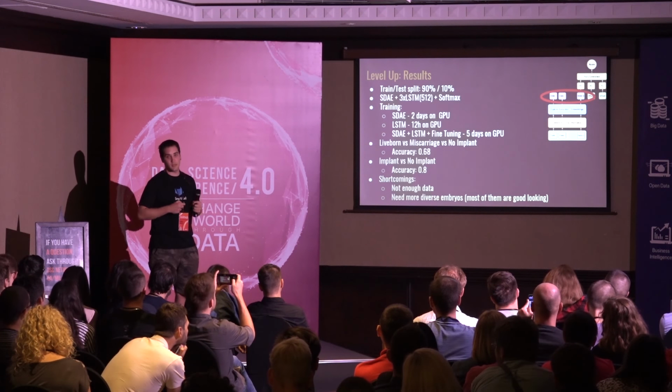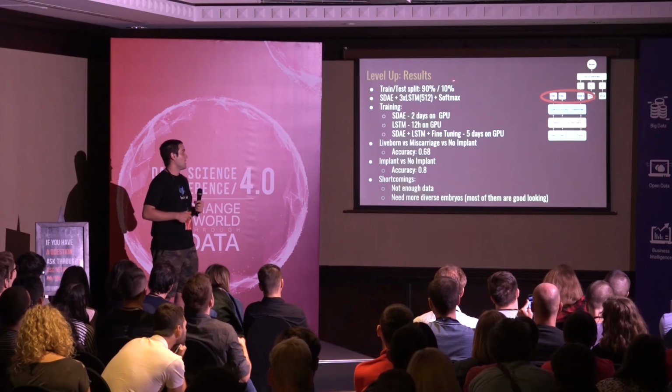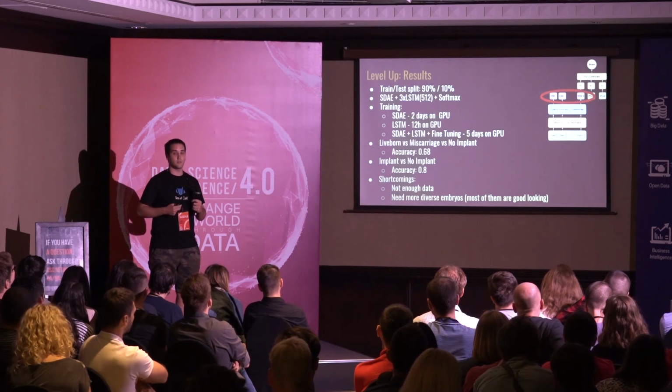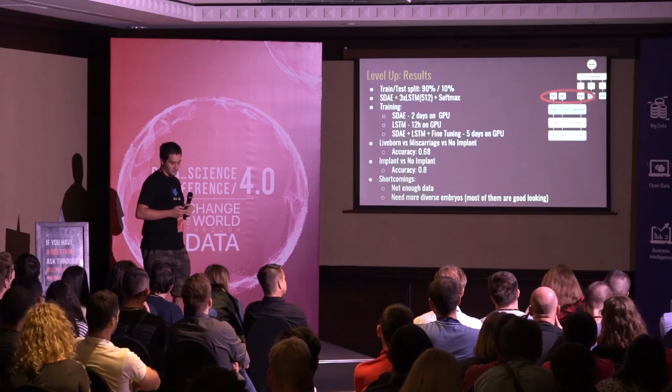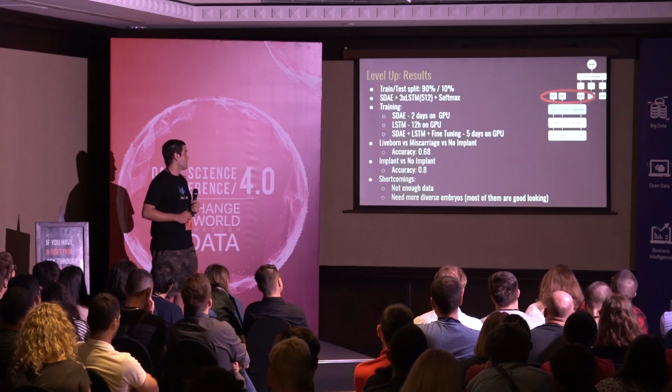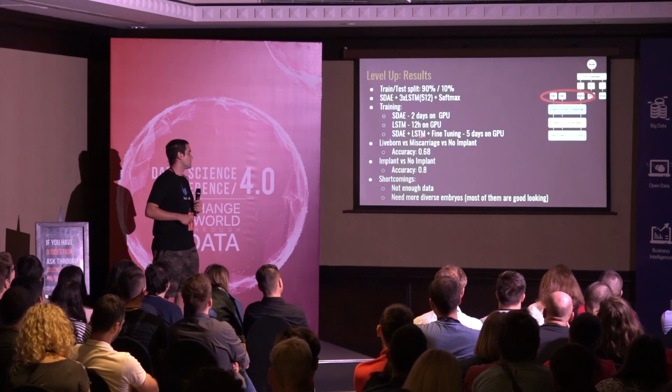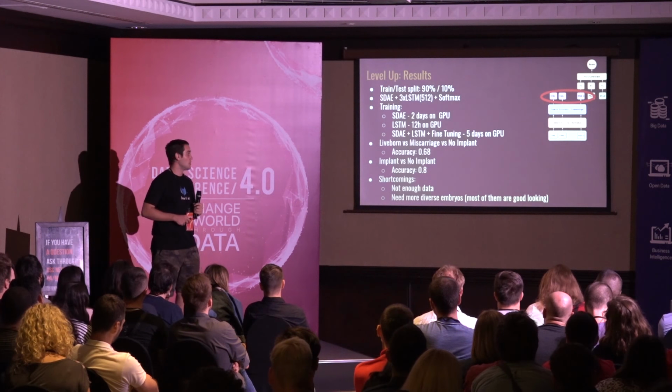Then we train the LSTM neural network, and after that comes a softmax layer. The training took this amount of time. These are the accuracies we got.